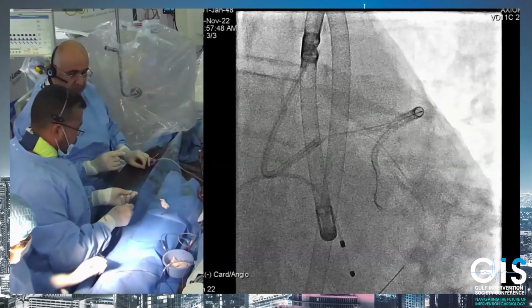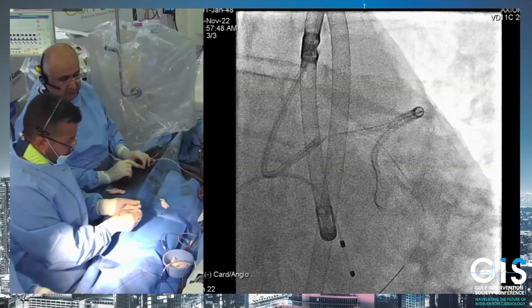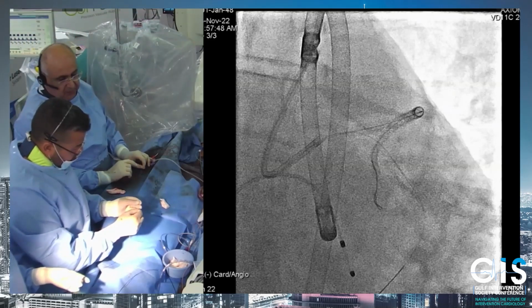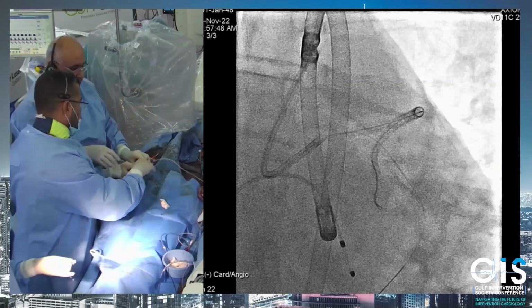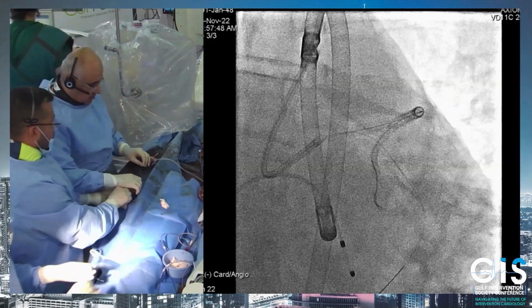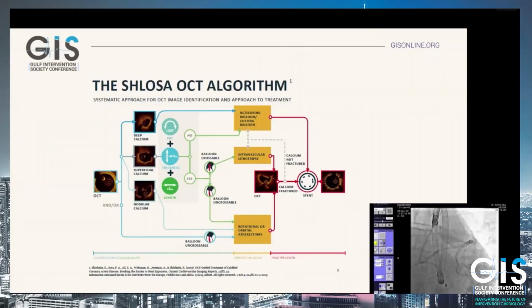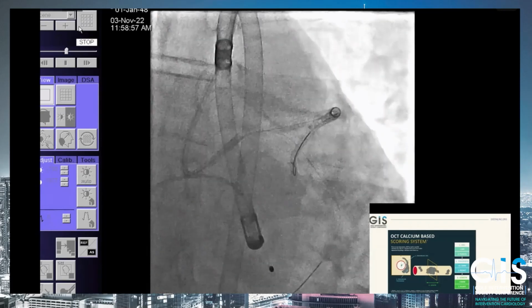Gabriel, any preference, IVUS or OCT in this scenario? No, in this scenario, no difference between IVUS and OCT. Maybe some concern because of kidney disease. It could be better to use IVUS because you don't need to inject contrast. And then if you need to evaluate the left main, IVUS could provide better information. But anyway, in terms of evaluating the calcified lesion, OCT could be better, but you should decide according to the patient and the lesion that you are going to treat.